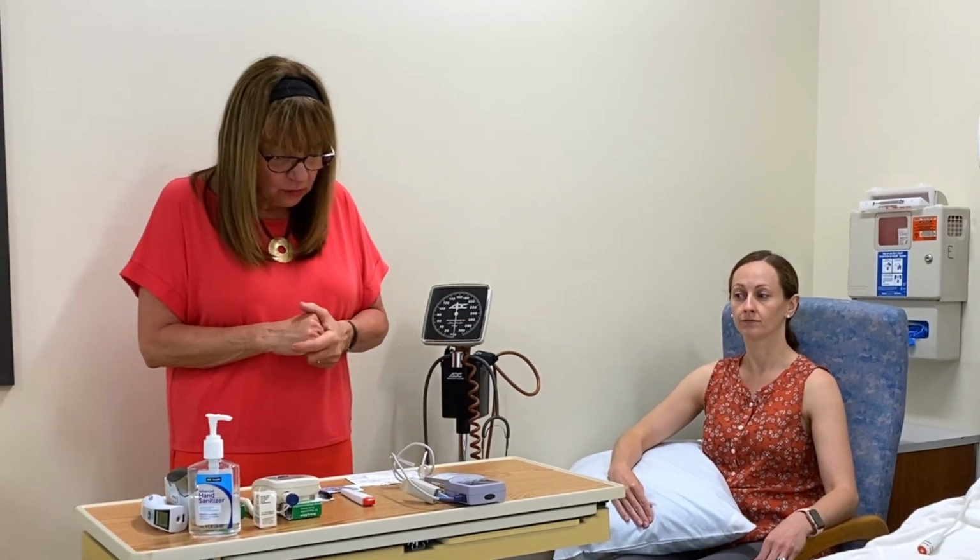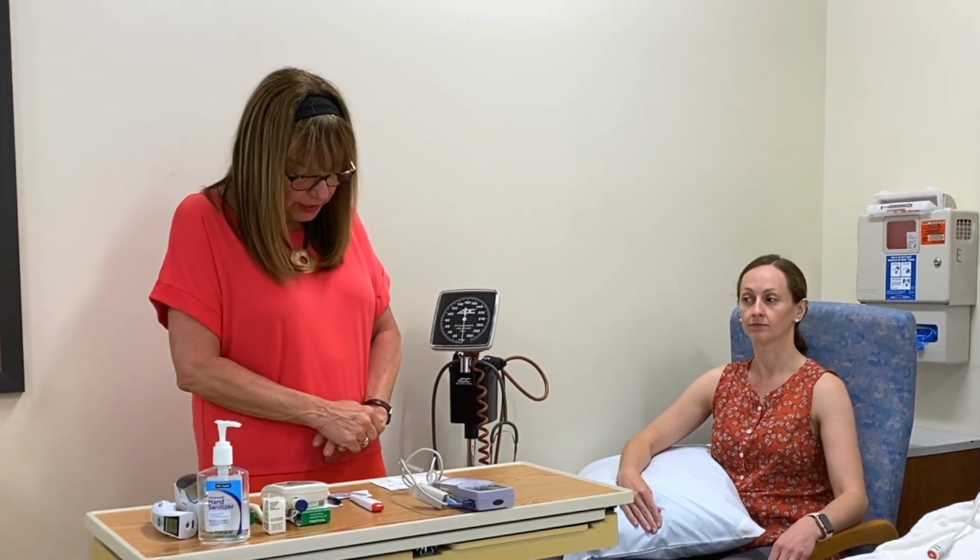It's a gross measure. It's not as accurate as certainly an arterial blood gas, but it's a good measure. Normally what we teach students is that the SpO2 needs to be about 95, and that you need to report an SpO2 of under 90% immediately to your instructor or primary nurse. There are many things that can affect the SpO2, and that's peripheral circulation. So we need to check cap refill, see if the fingers are warm, check for a pulse, and that will increase the accuracy of the reading.